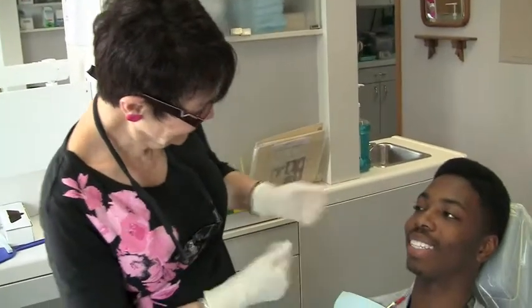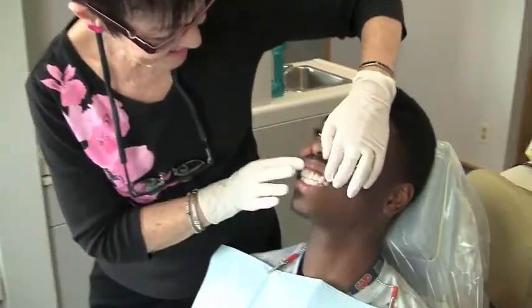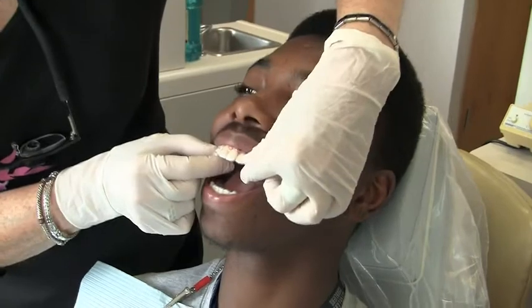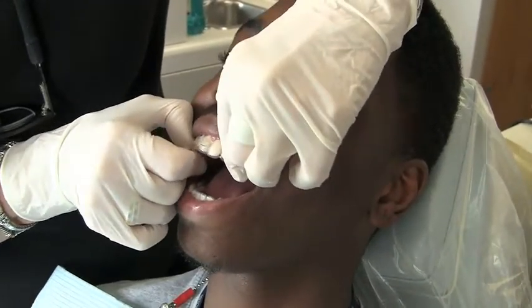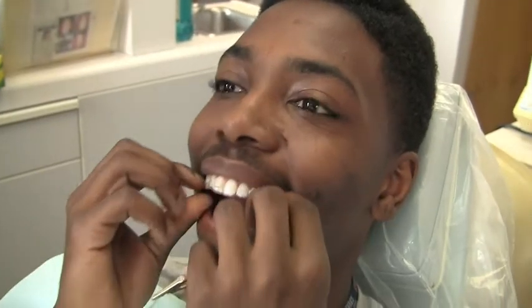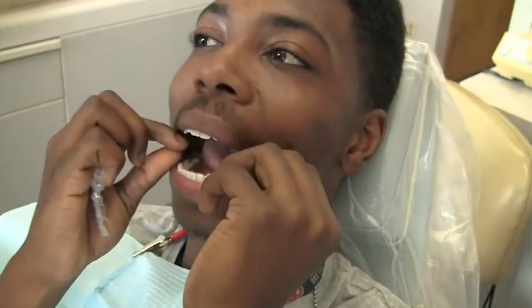How are you doing? Yeah, how are you? Good, let's have a look. Okay, let's see here. That looks good. We're going to take your aligner out. You can pop it out. Okay. Good, good job. Great. Okay.